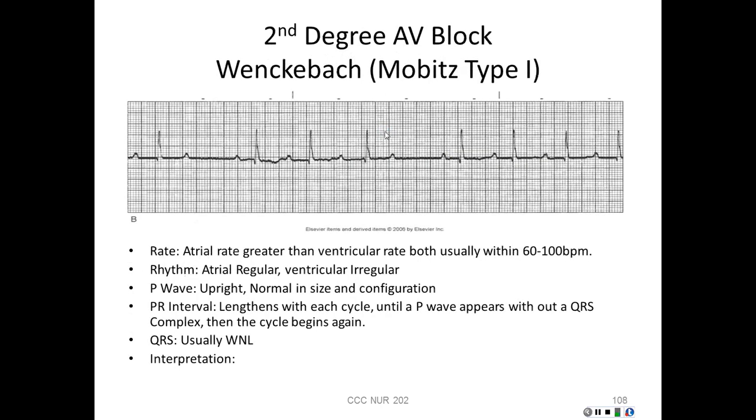Second-degree block is broken down into two types of blocks. It's broken down into Mobitz type 1 and Mobitz type 2. I will post for you a cute little video on Wenckebach, or Mobitz type 1, that may help you understand a little bit better.